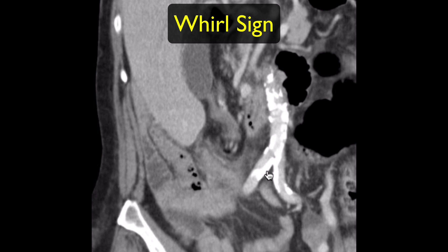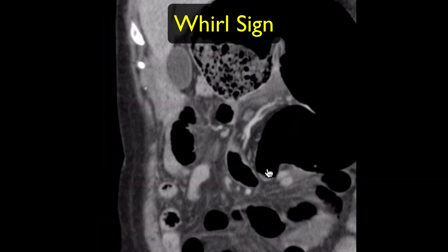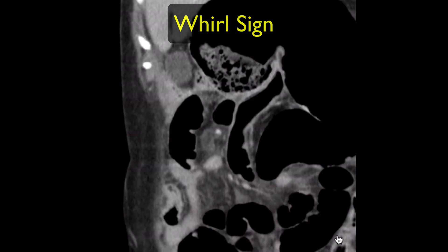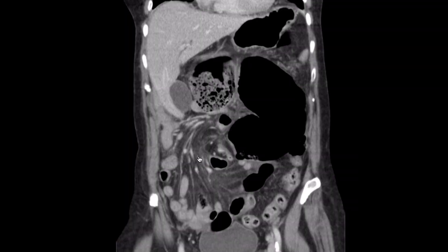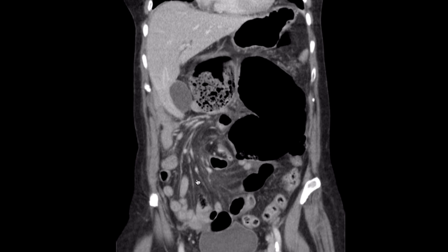This is known as the Whirl sign. There is also a small volume of free fluid between the bowel loops. The cecum has rotated and twisted as it has an unusually large mesentery which makes it more mobile than usual. It normally resides in the right iliac fossa, but this location is now filled with small bowel loops.